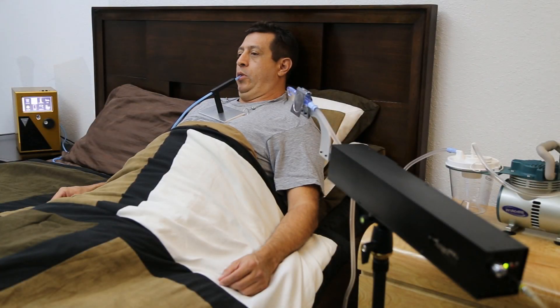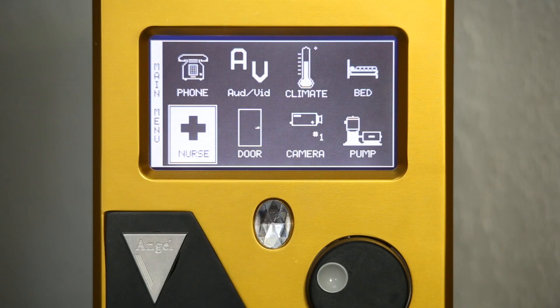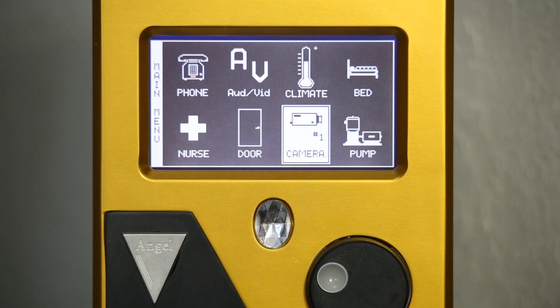Telephone. Audio. Climate control. Bed. Nurse call. Door. Camera. Pump.